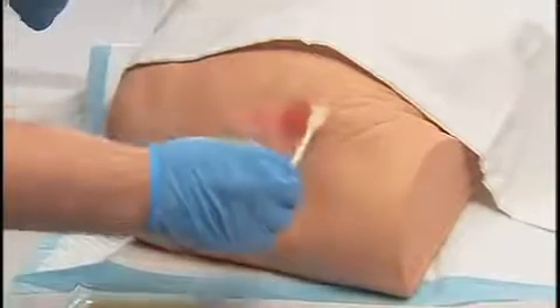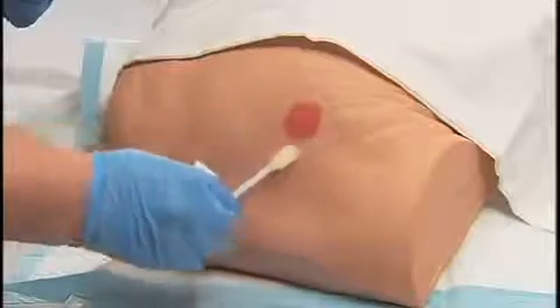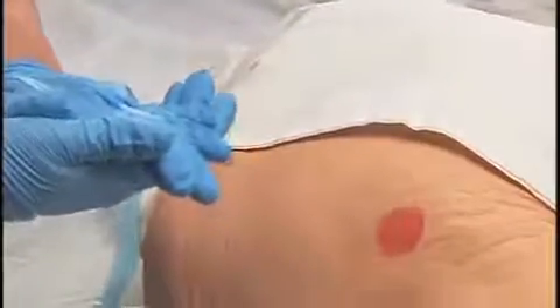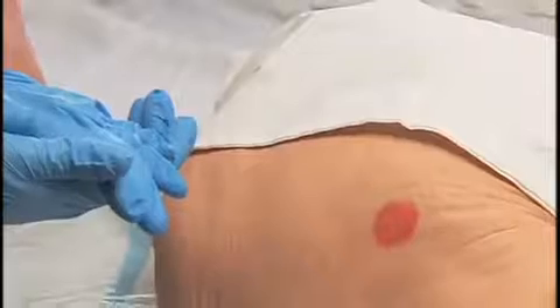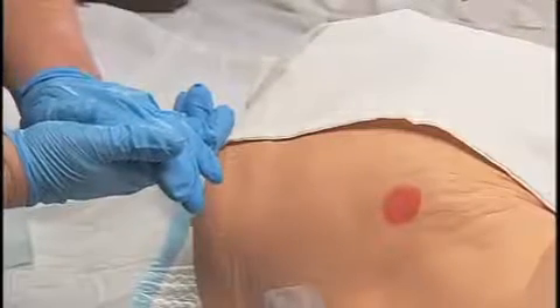To apply a hydrocolloid: if the peri-wound skin is fragile or exposure to drainage is likely, apply liquid barrier film to the peri-wound area. For deep wounds, apply wound filler or packing materials as indicated. Select the correct dressing size so that at least one inch of the dressing, including the adhesive border, extends beyond the wound edge.